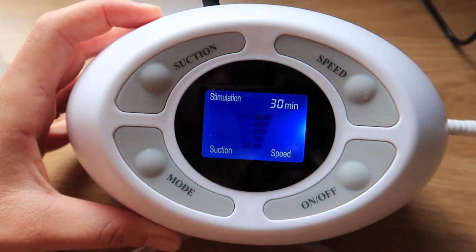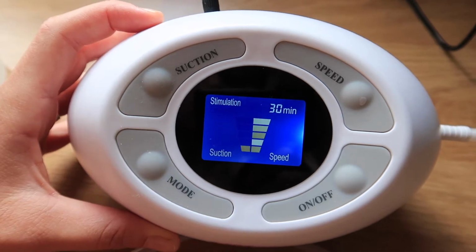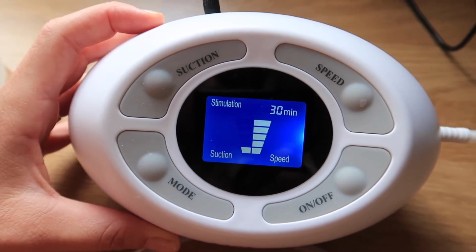Another thing that I found could be quite useful about having an electric breast pump is there's sort of different modes. You can set it to whatever suits you, and there's also like a little timer and it counts it down, or it times how long you've been pumping for. So that's quite helpful if you are going to be maybe exclusively pumping, so you can set the power of how strongly it pumps. So obviously if you're new at the start, you might not want the suction to be too hard to begin with. That was about the only pros that I actually found of using an electric breast pump.